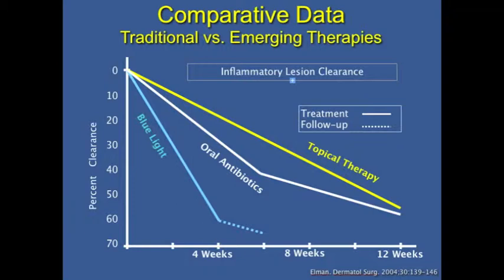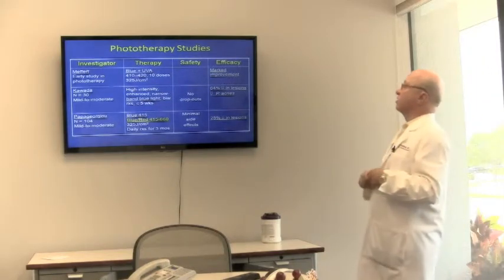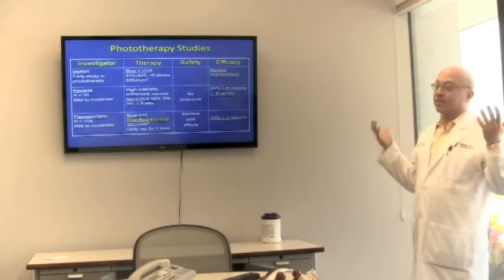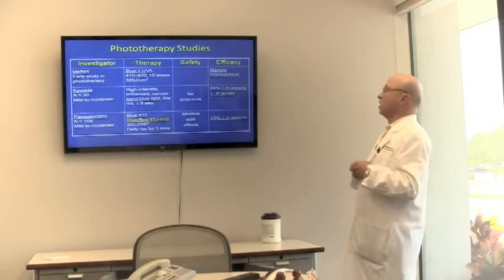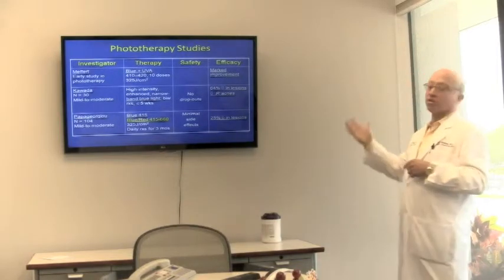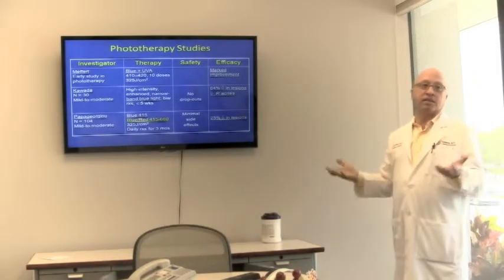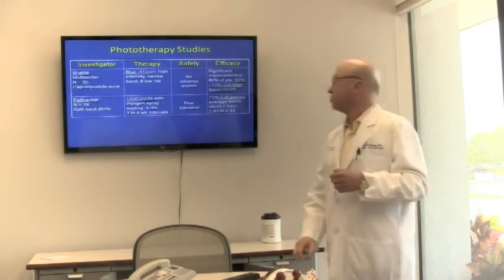But blue light really, and red light kill P. acnes. And so there's a lot of stuff out there. This one study looked at blue activated by ultraviolet, which we're not going to do at all. One looked at blue light treatment alone, and then a study looked at blue and red, which we've done some work in that area. And they all clearly decrease acne, and they decrease acne because they kill the bacteria without taking pills.